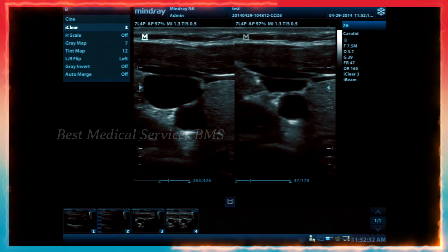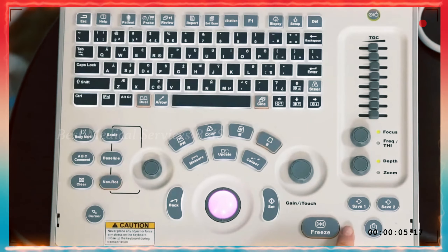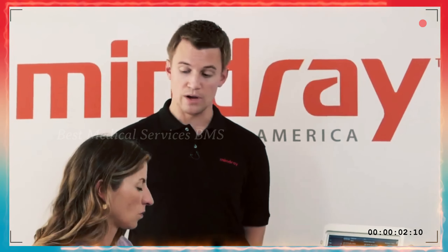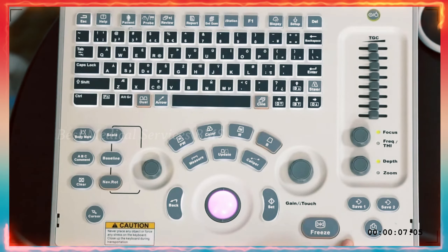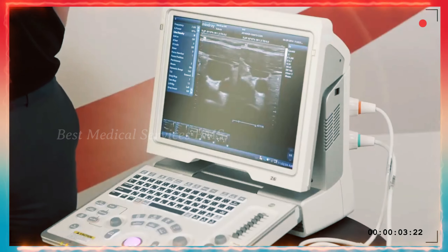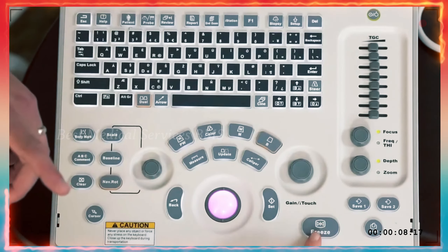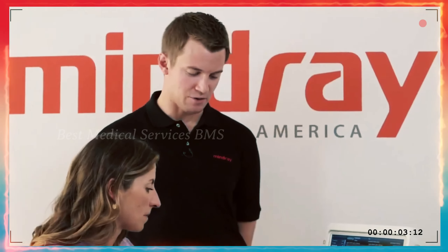Saving images: you'll see that you have two save buttons — save one and save two. Typically out of the box, save one will save a still image and save two will save a cine loop. The duration of the cine loop can be adjusted under the setup tab. To save a cine loop with save two, you do want to make sure you are frozen first, otherwise you'll get a message to freeze before saving the cine clip.